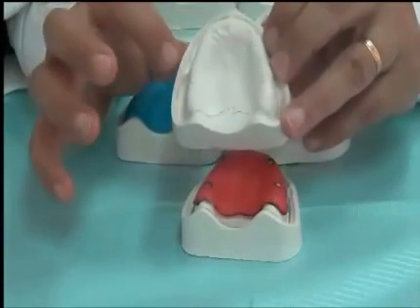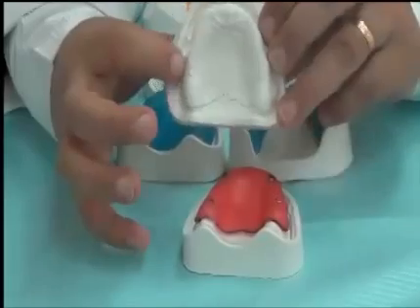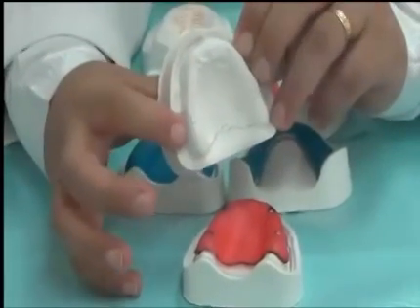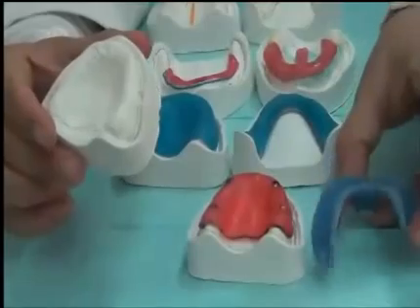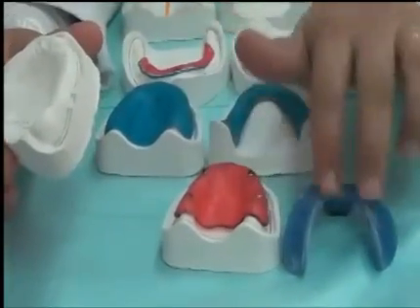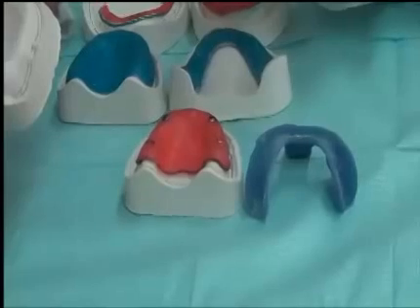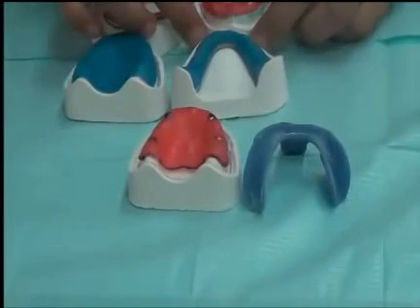So also the denture could go through the sulci and go in here and cause trauma to the patient later on. So taking a case where no relief is present or full relief is present are both, in the long term, hazardous to the patient and might cause harm. So for our purpose we choose to do partial relief.